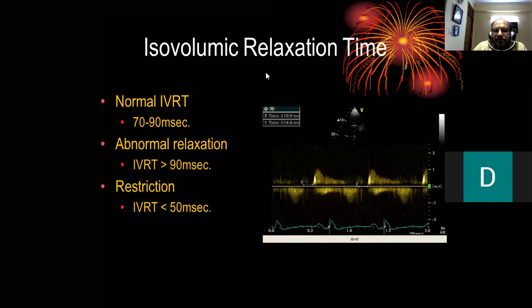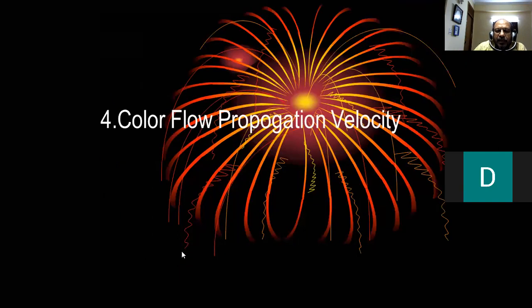Next comes IVRT. What is IVRT? Closure of the aortic valve, opening of the mitral valve, that is IVRT. So what do we do in IVRT? I'll come back to this IVRT in a couple of minutes.